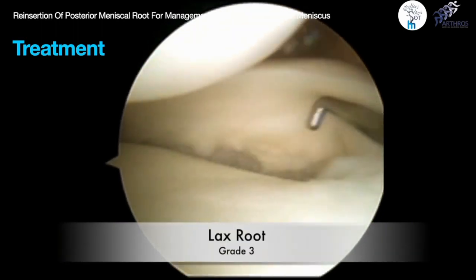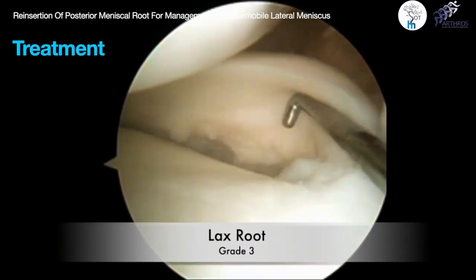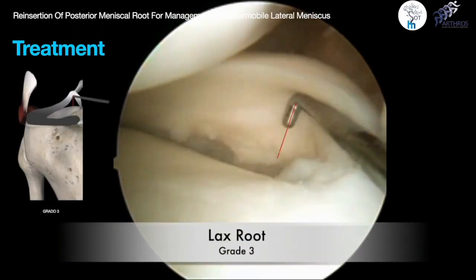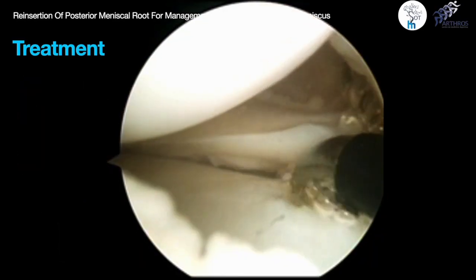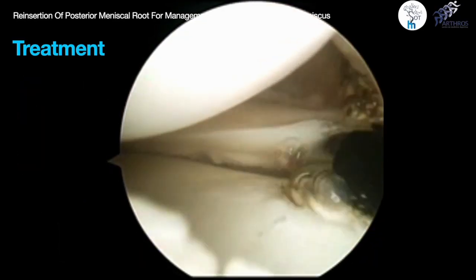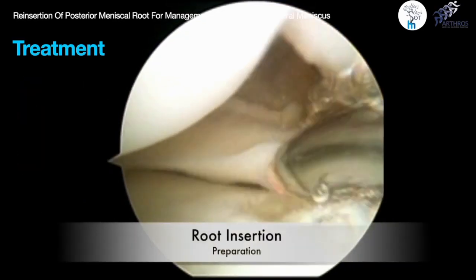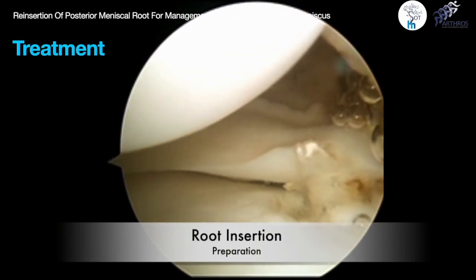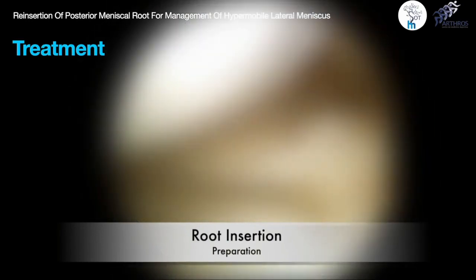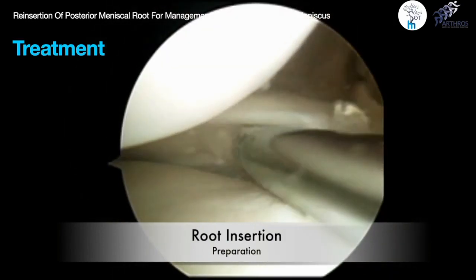We give a grade 3 with R classification. We then perform debridement of the meniscal root footprint on the tibial plateau using a shaver and radiofrequency.